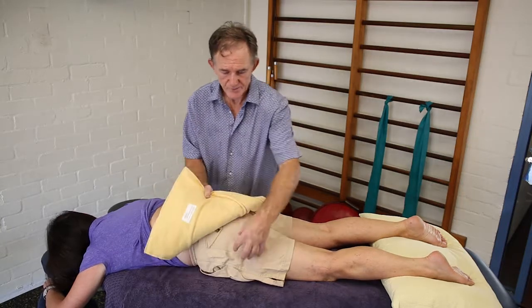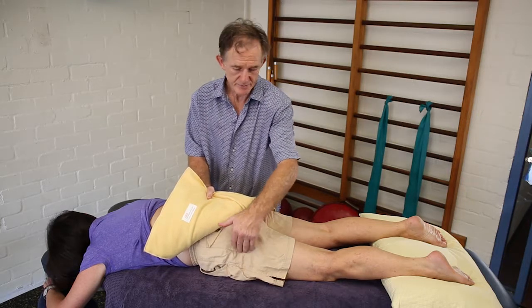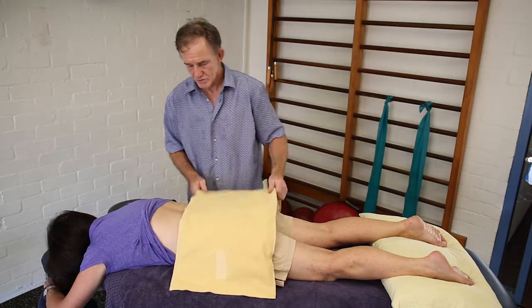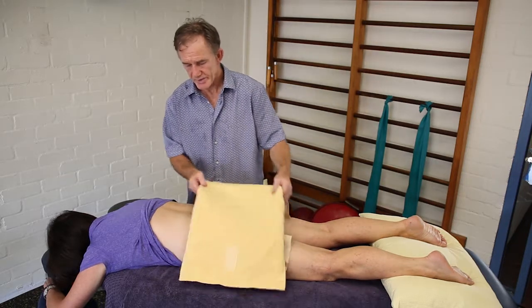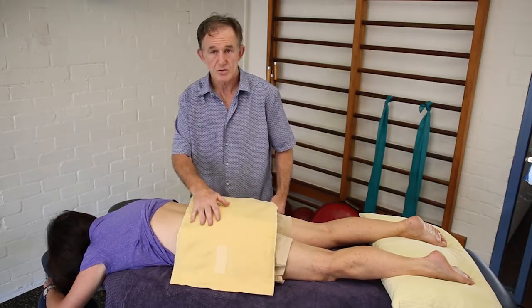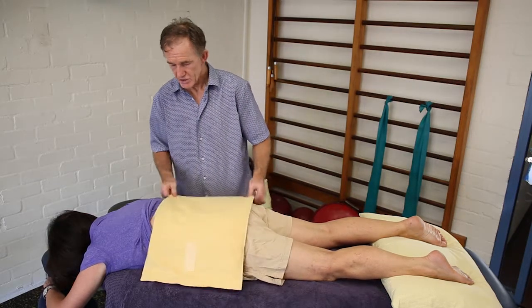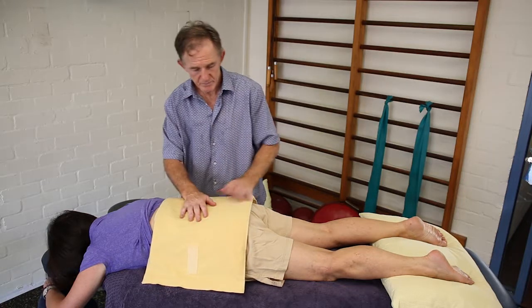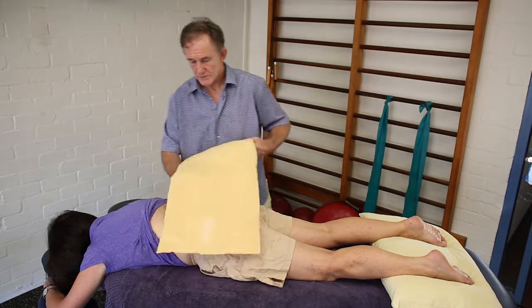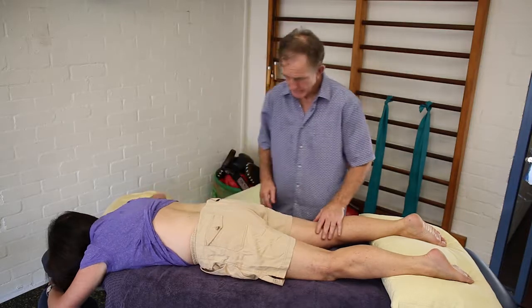With bursitis, if it was really severe, the management is sometimes to get an ultrasound, and if it's swollen, we can then give a cortisone injection. But remember, with Susan's chronic condition, that degeneration, and the fact she had a sitting job with long hours of sitting, would have been a strong contributing factor to Sue's problem. So this is how, as a clinician, I would use the product for Sue, for her lumbar back and her bursitis, minus the trousers.